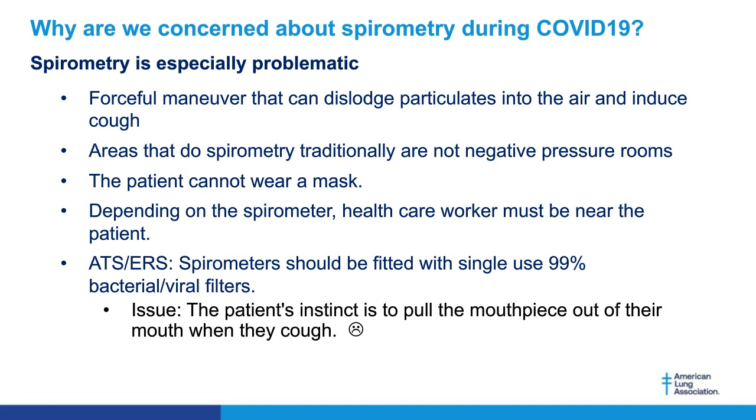Well, in patients that have airflow obstruction, emptying the lungs all the way down to residual volume usually will trigger a cough, especially in our COPD patients and our cystic fibrosis patients. And so they cough, and there's no doubt about it. In our research on particulate, coughing is what spreads the most particulates, especially the particulates of the size that could carry a virus. We're talking about particulates that are less than 5 microns in size.